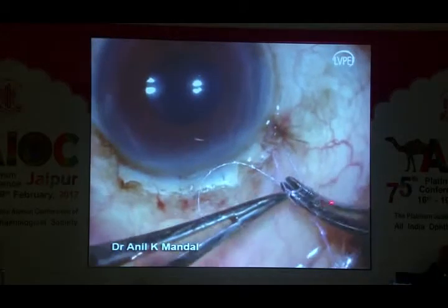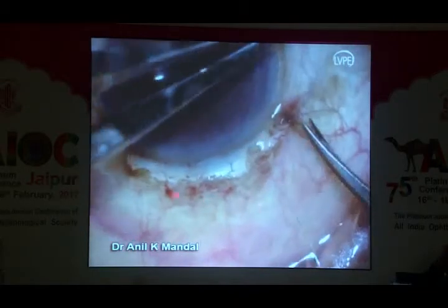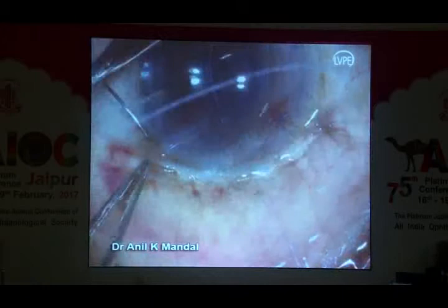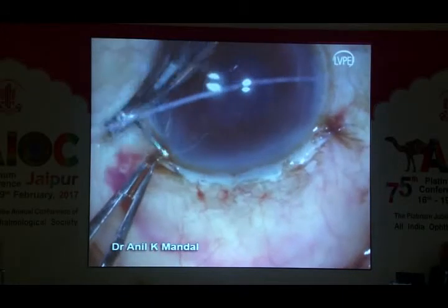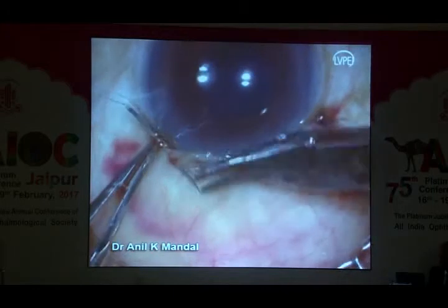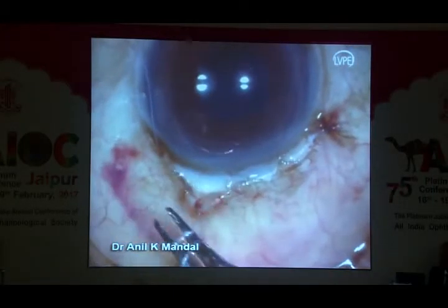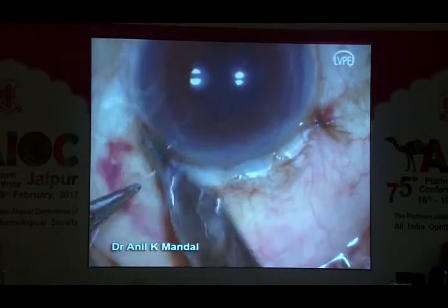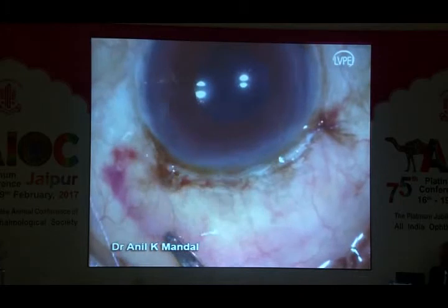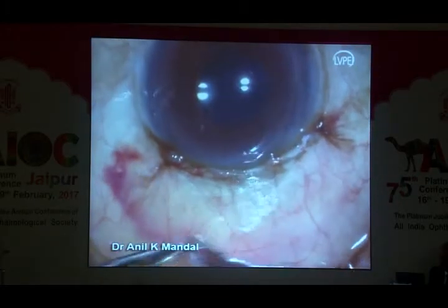This is a very simple technique. Once you have learned trabeculectomy and SICS, you can just combine like this. What I have learned and felt, having analyzed my results, is that the technique gives equally good results compared to phacotrabeculectomy. I do not want to convey the message that phacotrabeculectomy, intraocular pressure lowering effect-wise or quality-wise, is in any way less than this, but it gives very good results.